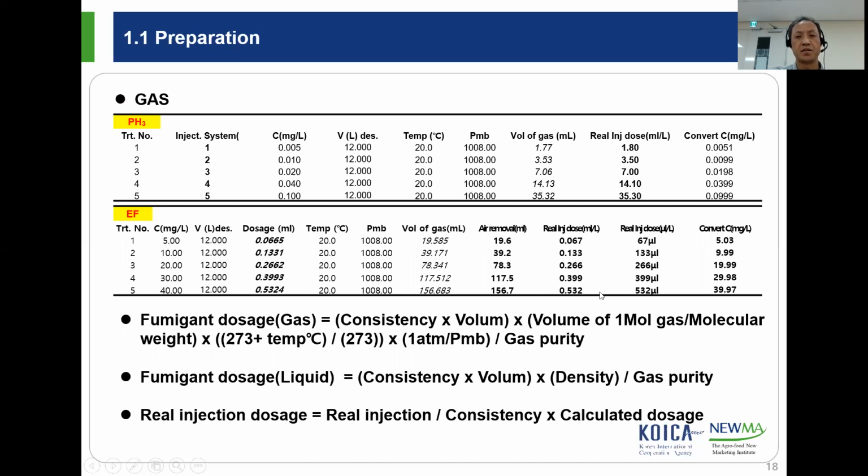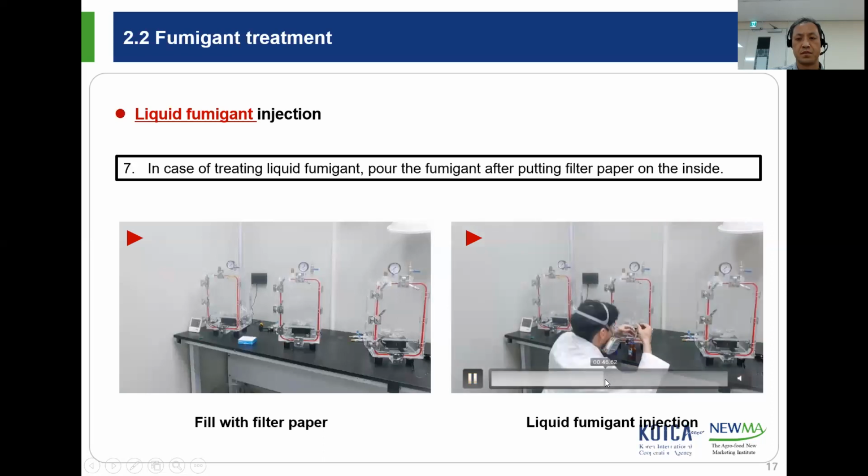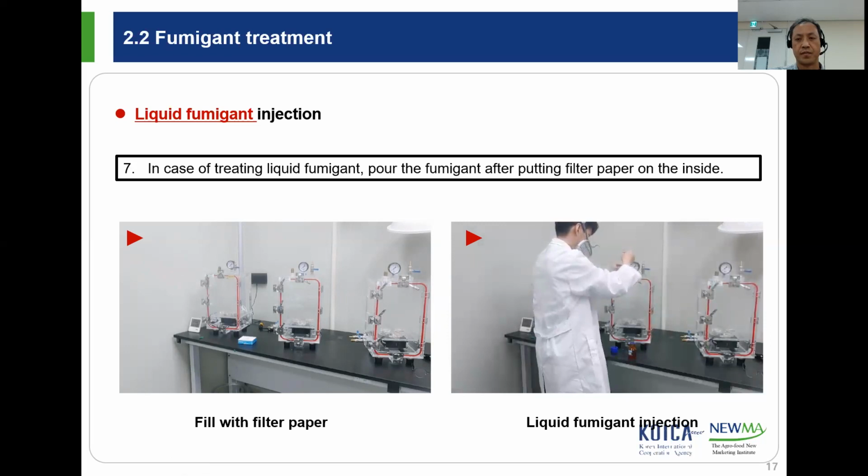Maybe this exercise includes that. Just like this, they inject that with the liquid.